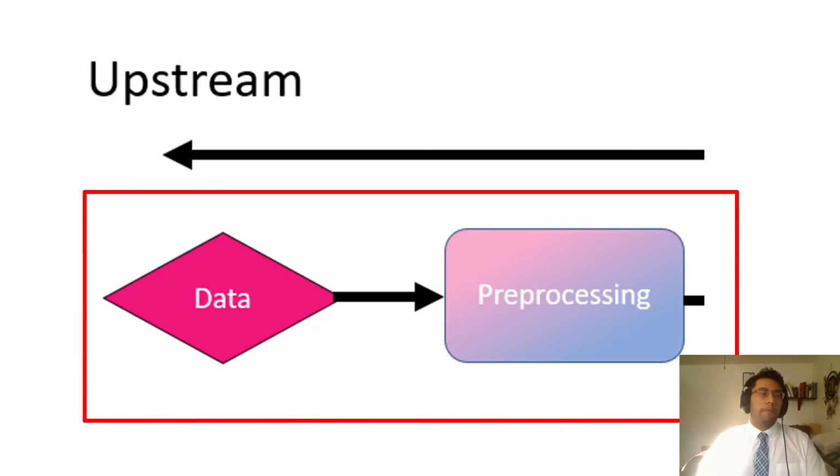All right, so essentially what I explained is the data itself, its data structure, what a DICOM file is and what it contains. And then pre-processing, converting the data into values that are usable by a deep learning model.